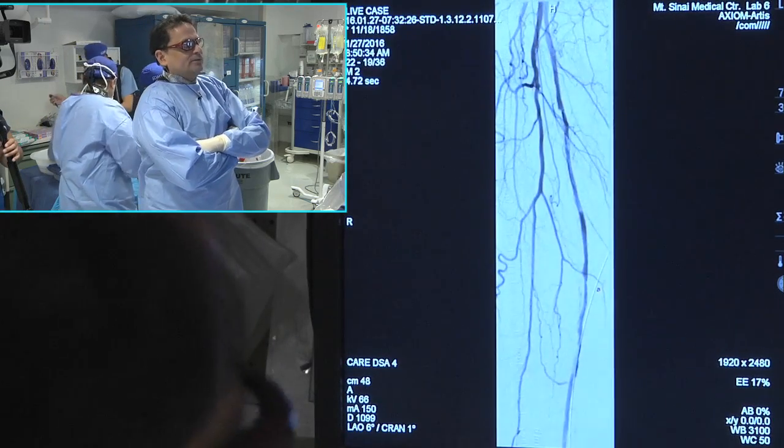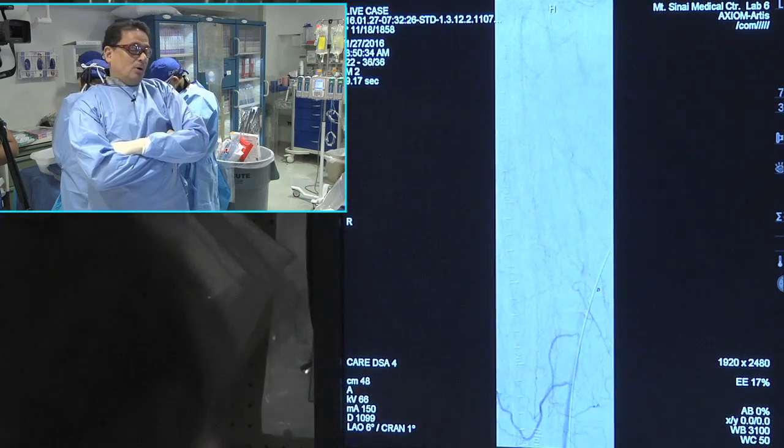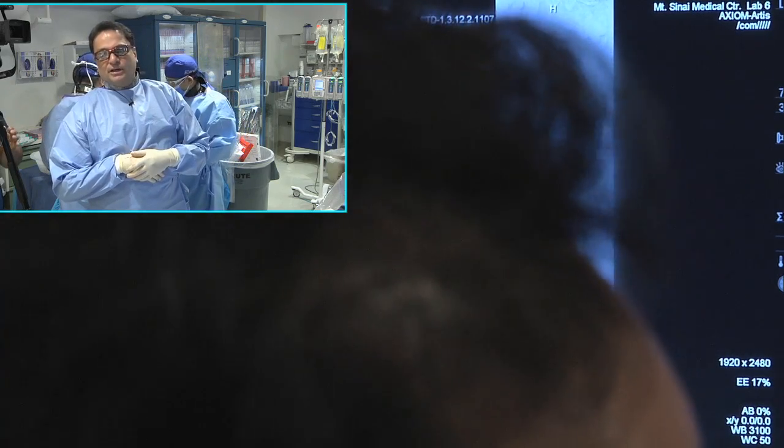So now we have decided to follow the Impact Global data, or you could follow the Lutonix data. What are we using, guys? You want to use Lutonix or Impact? What do you want to use? Oh, they already opened the Impact. So we generally could use both.